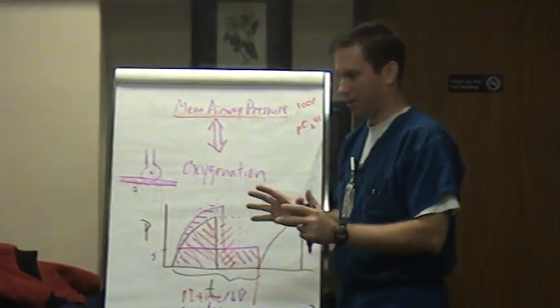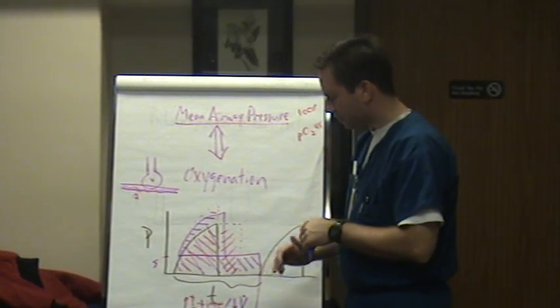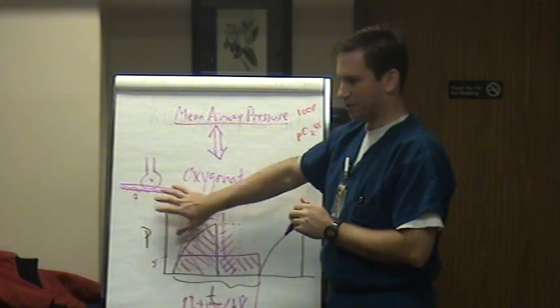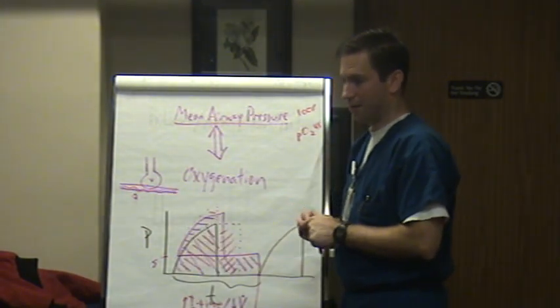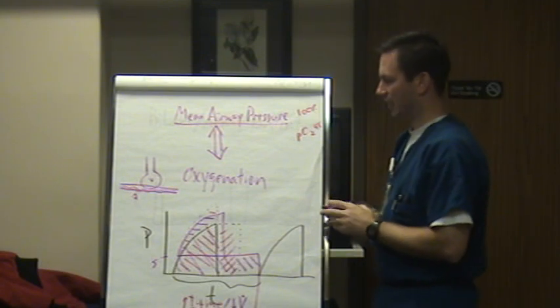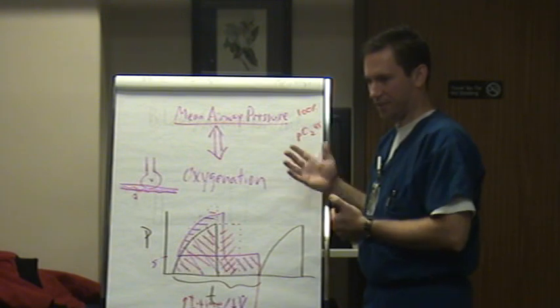Is us talking with y'all and the nurses and figuring out, is it a V problem or is it a Q problem? So, anytime you make these changes, you need to reassess Q, because it's going to impair pulmonary blood flow to a certain degree, especially on your sickest patients. So I'm not here to tell you that cranking up PEEP and all that fixes everybody.